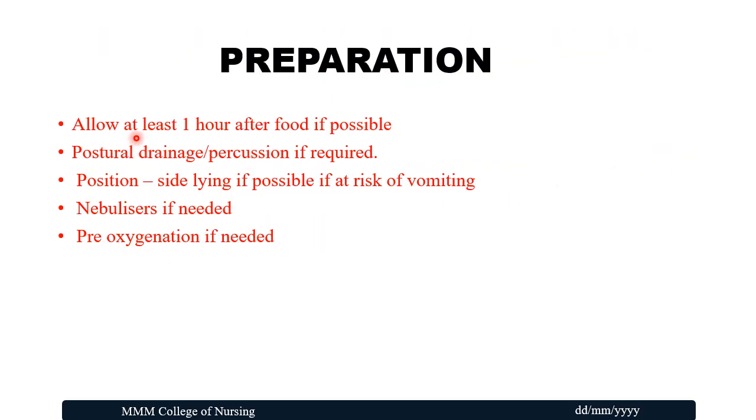Preparation. Allow at least 1 hour after food if possible. Postural drainage and percussion if required. Position: side lying if possible if at risk of vomiting. Nebulizers can be initiated before, and pre-oxygenation if required. So these are the things to be prepared before we do suction.